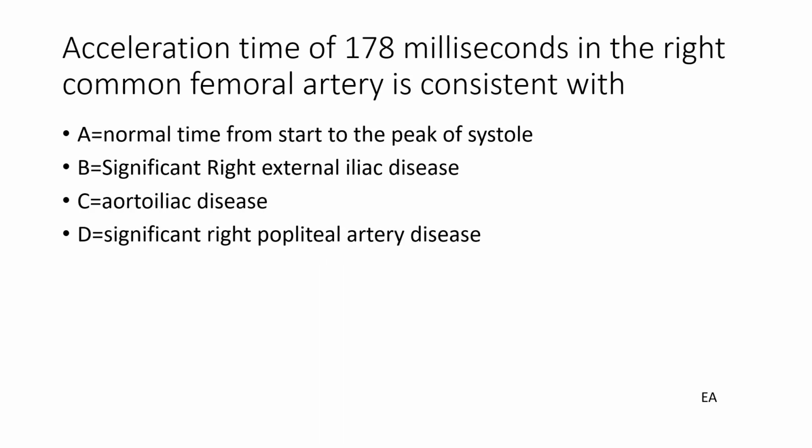Acceleration time means it is a question. I should explain something before. We have the y-axis for speed, velocity, or frequency, and the x-axis, always in spectral Doppler, is for time. So we have time and we have velocity, and it is about time, acceleration time.